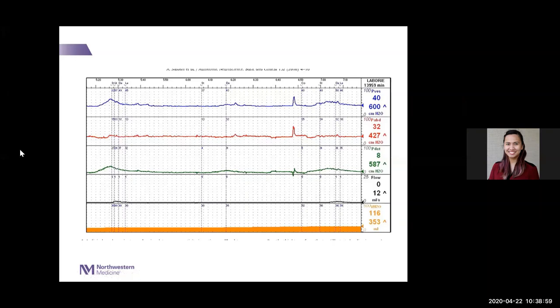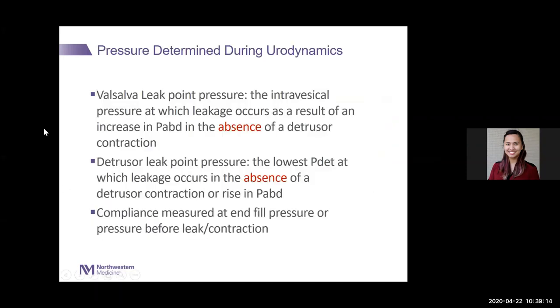And you can see there's little bits of leak if you see the flow here and flow here. I can tell you with little volume leakage, it's really hard to measure that. It's more by sensation or visually, you're in the room, because for that to trickle down and make it to where you're measuring the flow is difficult.